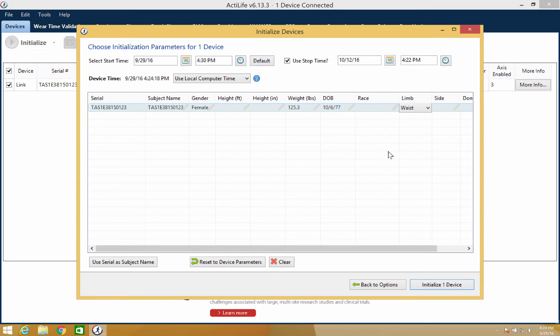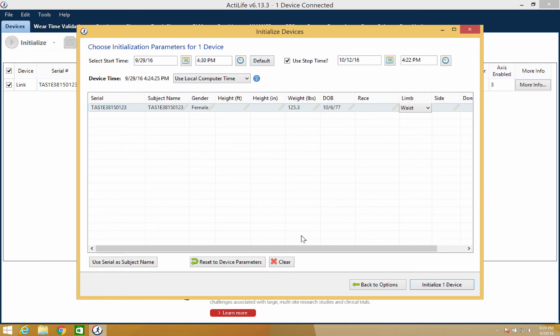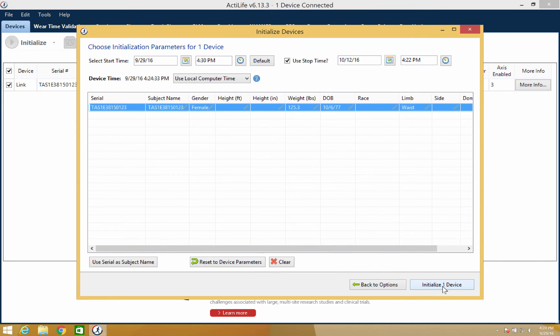You can also select reset to device parameters or clear to reset this information. Once the subject information is set, the device is ready to be initialized. Simply click initialize one device in the bottom right corner.